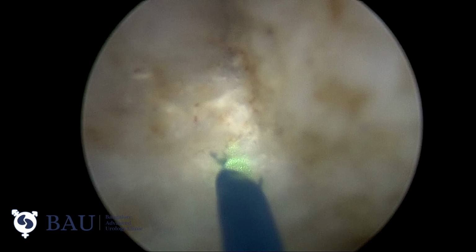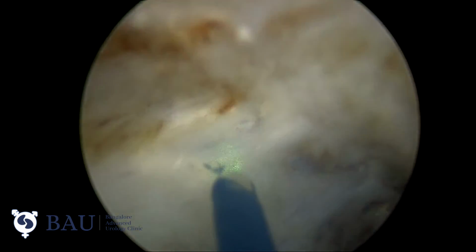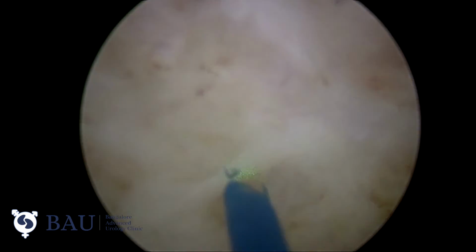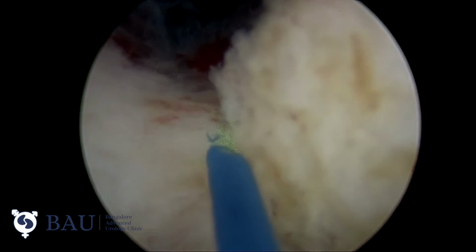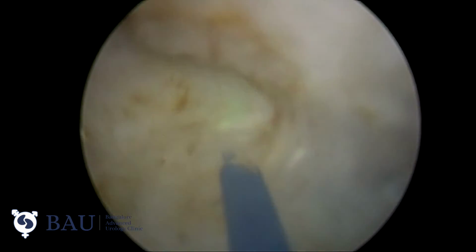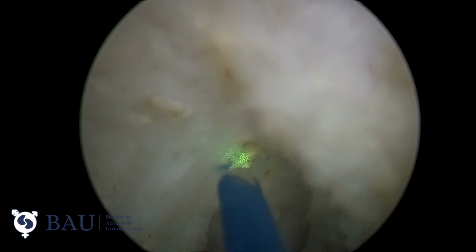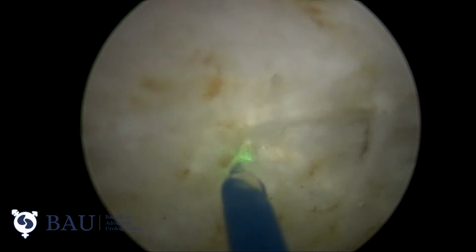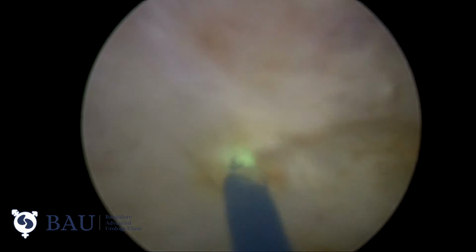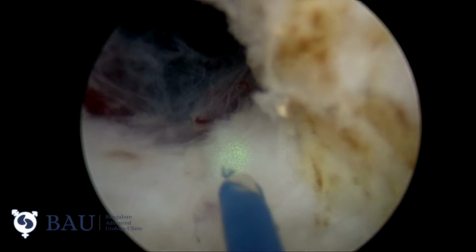Since we are coming from laterally, we can reorient ourselves towards the prostatic lobe and continue the dissection, thus avoiding any undermining or capsular perforations. See, I am going towards the prostate lobe rather than going into the capsule.